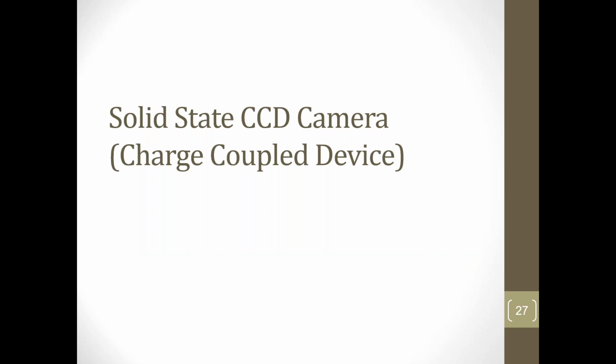So the next step in the technology was the charge-coupled device, and it's a solid-state camera. And that big box at the end of that first one that I showed you, the II, the big one, the end of the line one, had a CCD camera in it. That's what that big boxy thing is. So they were fairly sizable.